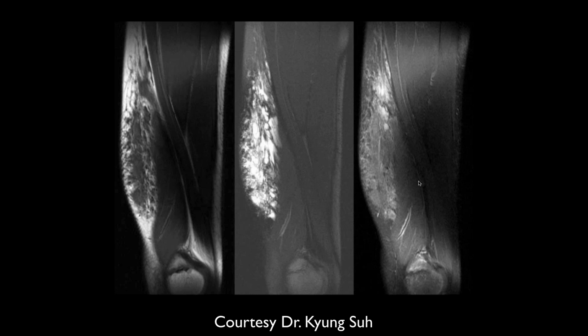Okay, well, it is markedly hyperintense on our STIR, kind of intermediate to low on T1. I don't really want to say 100% that there's enhancement, but there certainly probably is a little bit. I'm not seeing any hypointense foci like phleboliths. It could still be a low-flow vascular malformation, although we kind of see fat going into it in lobules that are pretty characteristic of a malformation.